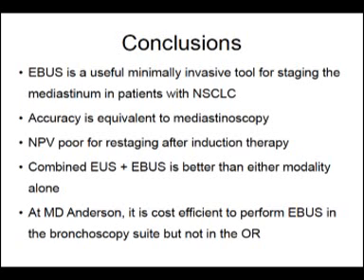Next, please. And at least at Anderson, these procedures, where possible, should not be done in the operating room, but in the bronchoscopy suite.